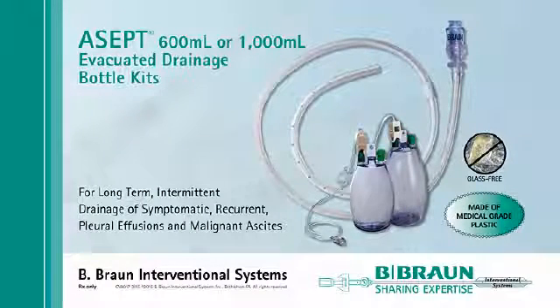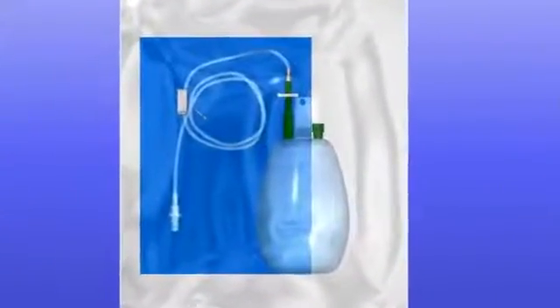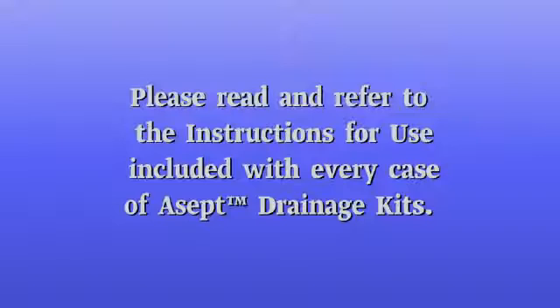This animation is a guide to help you use the ASEPT Drainage Kit. Depending on your prescription, you have been provided with a single 600 milliliter or 1000 milliliter bottle drainage kit. Please read and refer to the instructions for use included with every case of ASEPT drainage kits.